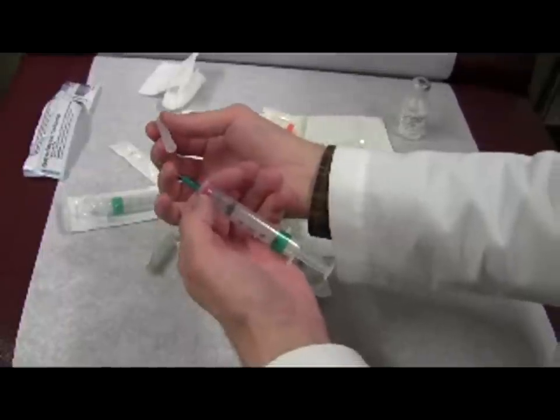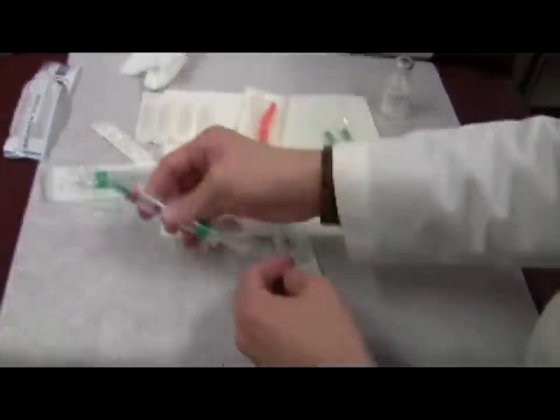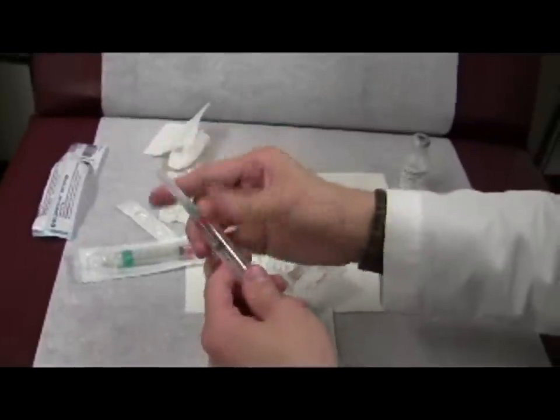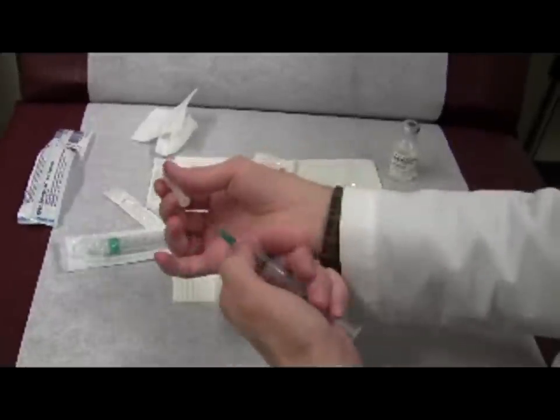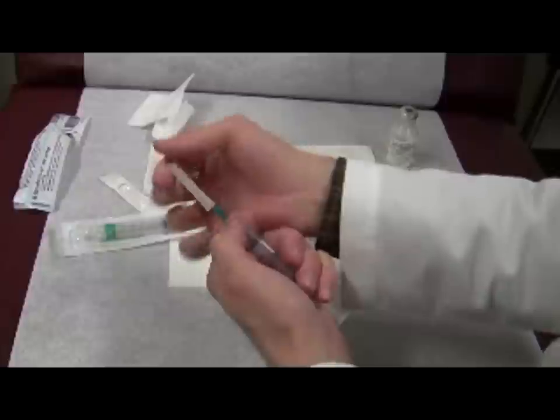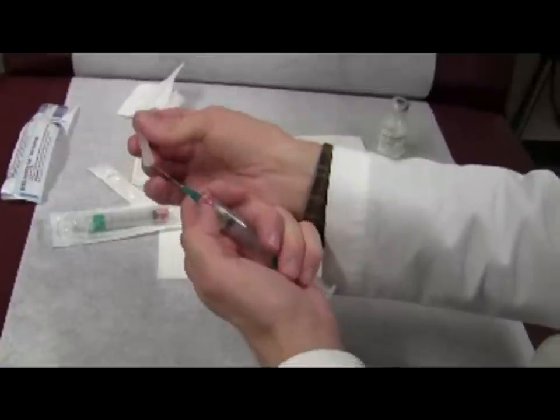When recapping a needle, ideally it should be done without your fingers near the tip. Especially if this is contaminated, you leave it on the tray, and then snap it into place. In practicality, if this is a clean needle, I just do the reverse motion and try to keep my fingers out of the way, make sure it's in, and then do that. The whole point is just not to rush — if you rush and you think it's in but it's not, you stick yourself.